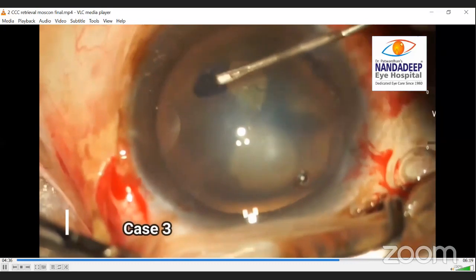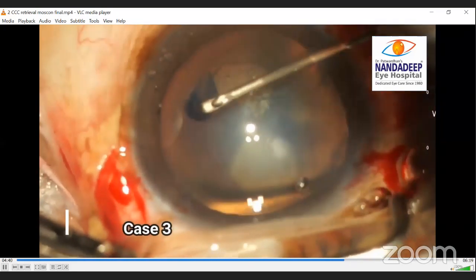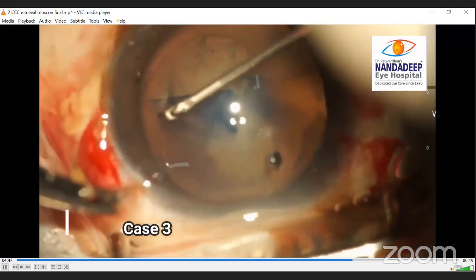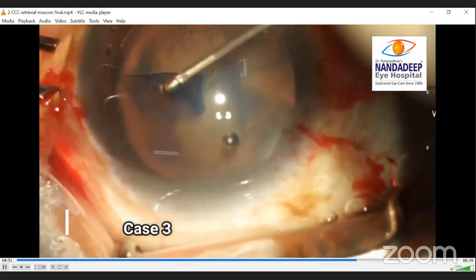And it is surprising how many times even we feel that the rexis has gone out, but it still comes back with this quick pull technique. Of course, it breaks a few zonules in that area, but then you can complete Phaco and place IOL in the sulcus.